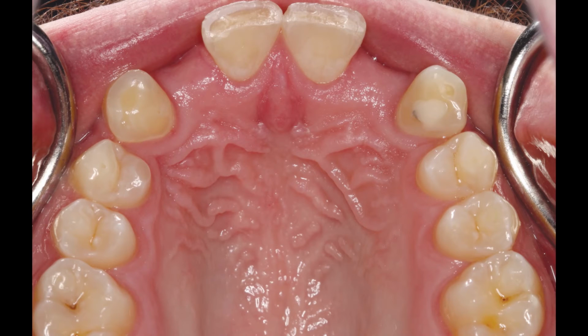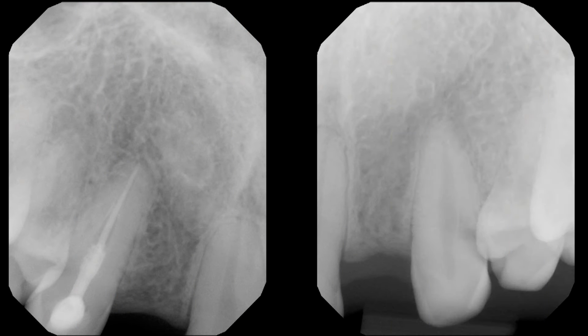When placing dental implants, the dentist must be certain that the angulation, depth, and position of the implants are appropriate to allow for a natural emergence profile, which requires a comprehensive evaluation of the patient's bone volume and anatomy. Several techniques are available to achieve this goal.